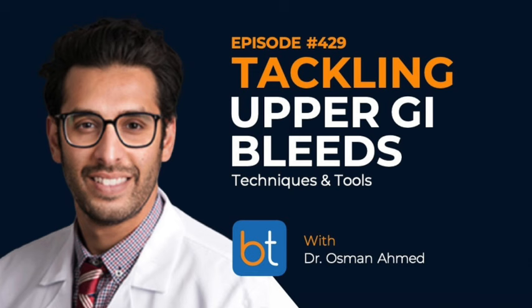Again, the reality is upper GI bleeding falls into that bread and butter IR category. So you're probably going to be able to get this etiology or pathology treated with pretty much any microcatheter that you have on your shelf. A lot of it just comes down to operator comfort and what you like to use.